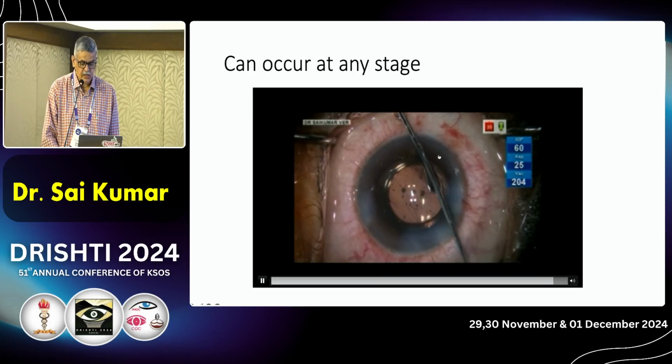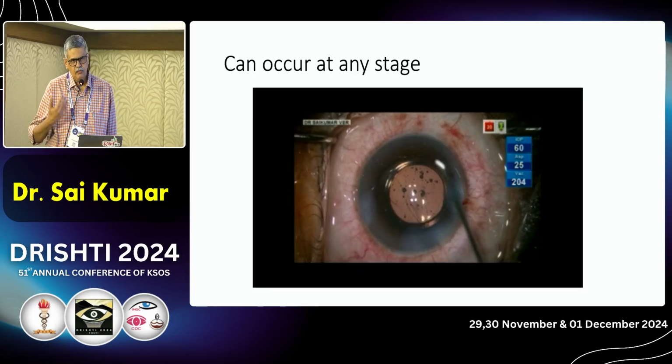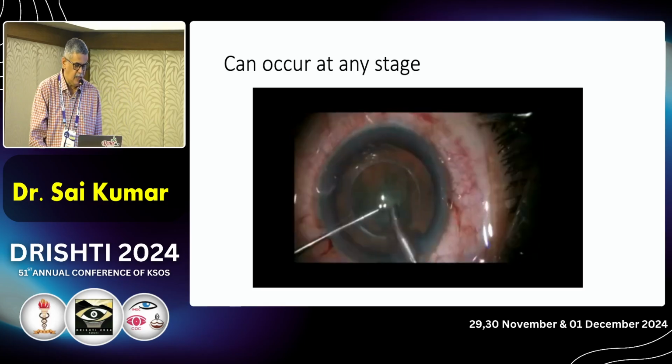But if you have the lens being stable inside the bag, the haptics are oriented in a way that the lens is not moving. I have not seen a reverse rupture so far. We talk about wraparound tears where you have a rhexis cut and the rhexis cut goes behind. But technically it can happen: you can have a PPC with a split capsule. It can come into the anterior capsular margin and break the rhexis margin as well. I haven't seen it so far. I don't know whether it's a described entity called a reverse wraparound tear.